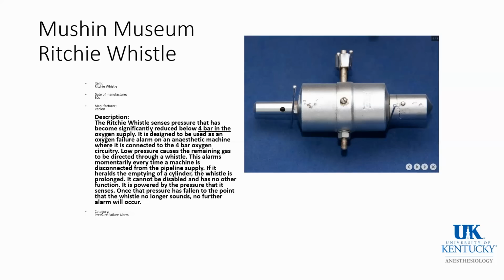A slightly more modern oxygen failure device was the Ritchie whistle, and it was brought into manufacture and use in the 1980s.